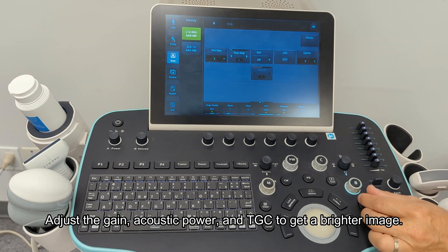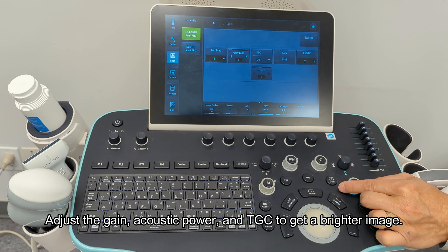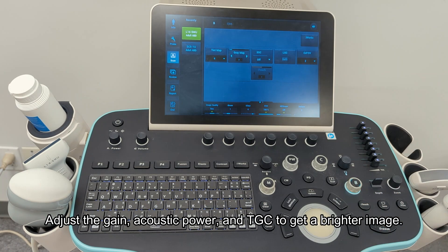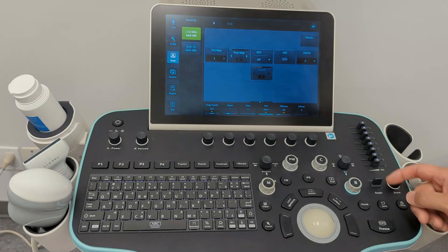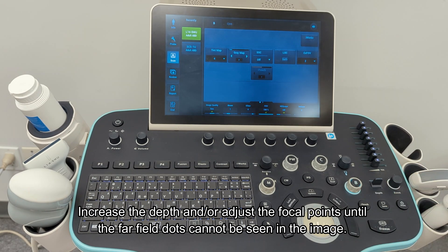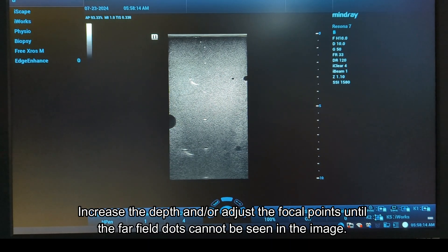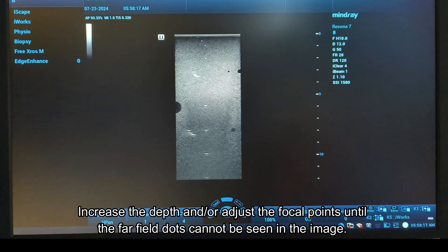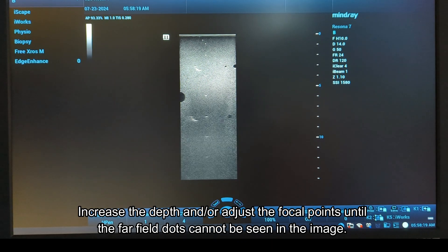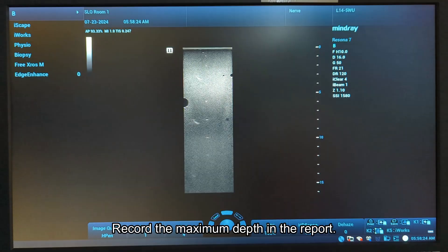Adjust the gain, acoustic power, and TGC to get a brighter image. Increase the depth and/or adjust the focal points until the far field dots cannot be seen in the image. Record the maximum depth in the report.